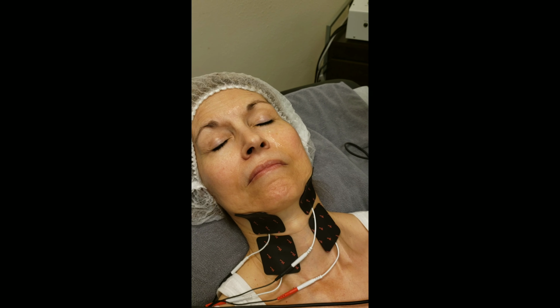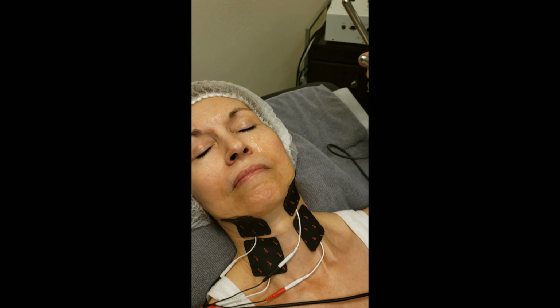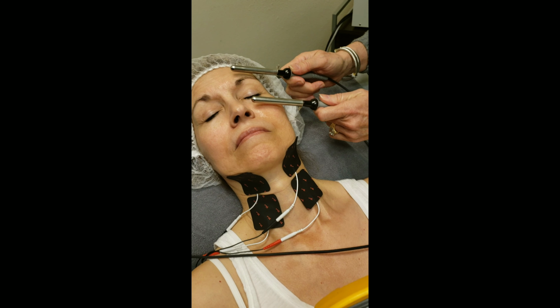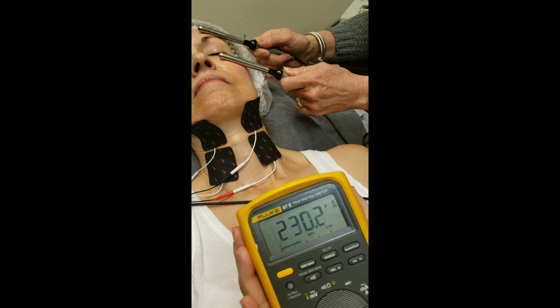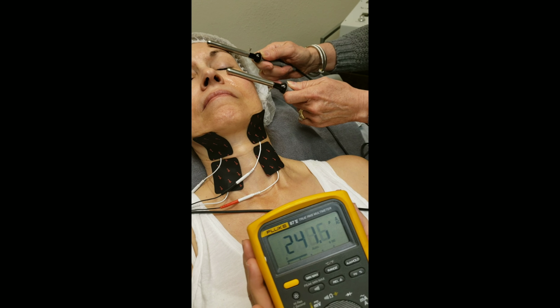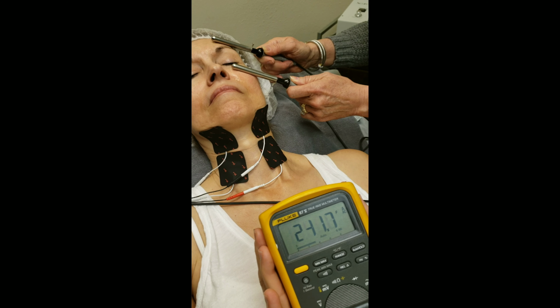So right now we're using channel 1, channel 2, and now the probes on channel 3. We'll see how much current is actually going to be delivered through the probe. So go ahead, Patty. Just place it on the skin as if you were going to do an eye treatment. So let's watch the meter. Okay. Right now we're showing about 225 microamps, which is about half its maximum rated current that you're going to get delivered with the probes.